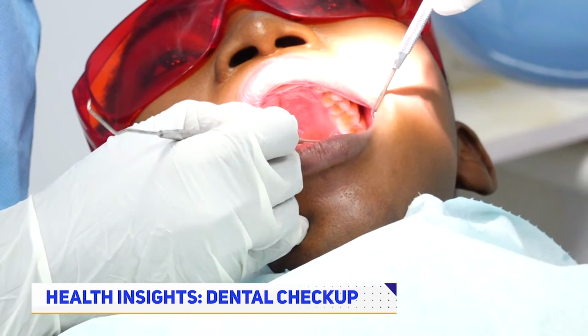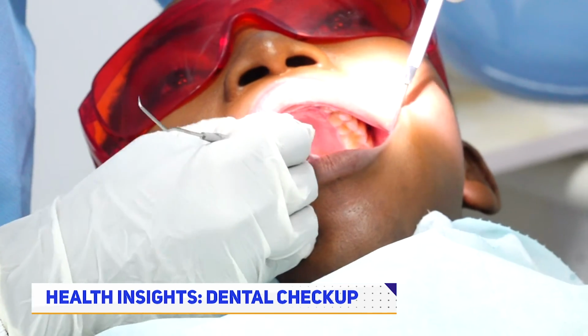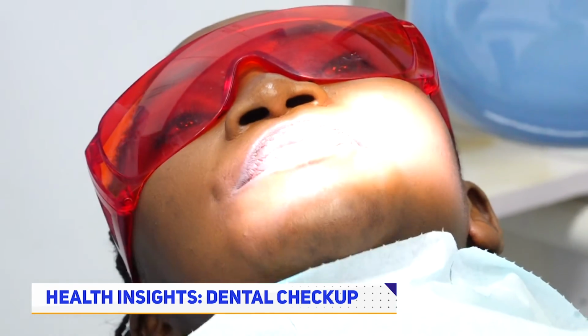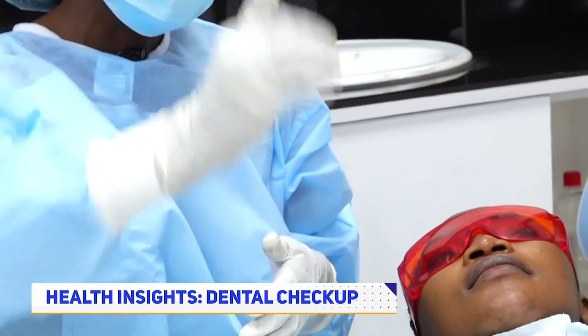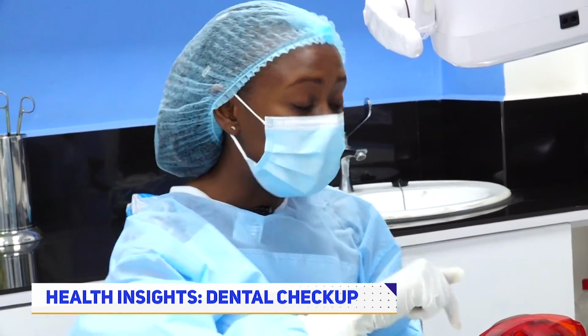In case I suspect the patient has dental decay between the teeth, I can send her for what we call dental radiographs or x-rays. What dental radiographs do is pick up any decay in between the teeth where our eyes are not able to see very well, or where we're not able to pick up with the probe.